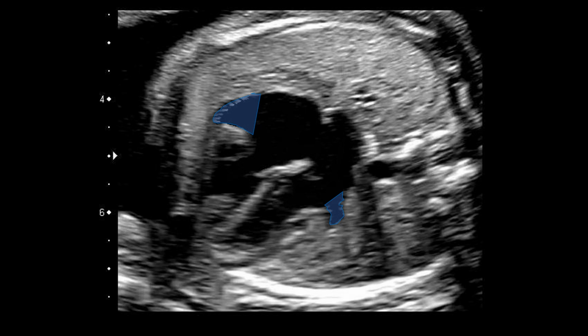They are clearly different in shape, and so you have this broad triangular shaped right atrial appendage on the right atrium, and this narrow finger-like atrial appendage for the left atrium. And these are features that you will see bilaterally in either left or right atrial isomerism. If you can get the picture clear enough, this is a good indicator of the subtype of heterotaxy that you may have in combination with the other features that may be found.